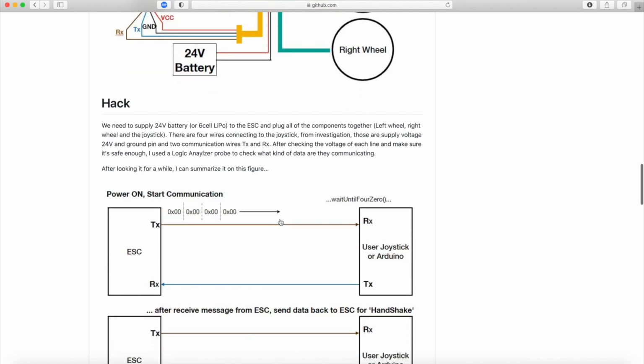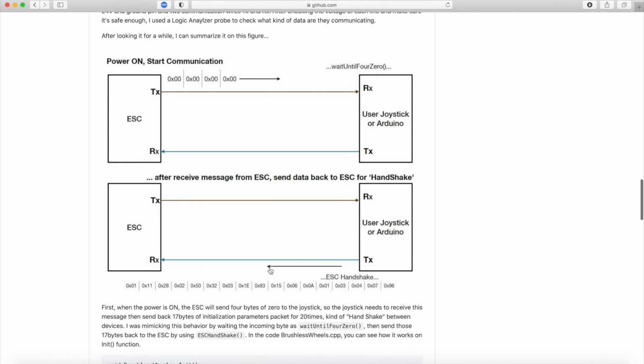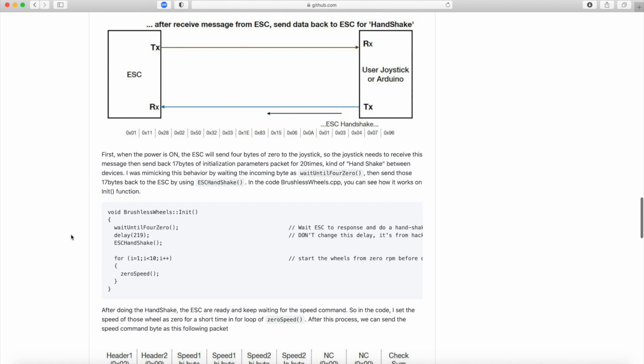From my hacking, this is the black ESC and this is the joystick. When both the ESC and the joystick get power, the ESC will start to send 4 bytes of 0 to the joystick, and then the joystick will send initialization parameters back to the ESC 20 times. I figured out that these 17 bytes are the parameters of the wheels, for example the low voltage cutoff, and also the brake, acceleration and velocity we can set from these parameters. Here I explain how it initializes and does a handshake.